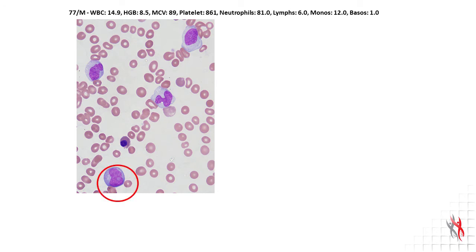As you can see in the bottom portion of the image, there is a monocyte with a gray portion of the nucleus that's punched out. That is a nucleolus. A nucleolus is a feature within the nucleus that indicates immaturity, and it typically should not be present in a patient with a reactive process. In this case, it really raises the possibility of CMML, especially when coupled with an elevated platelet count and an elevated white count.